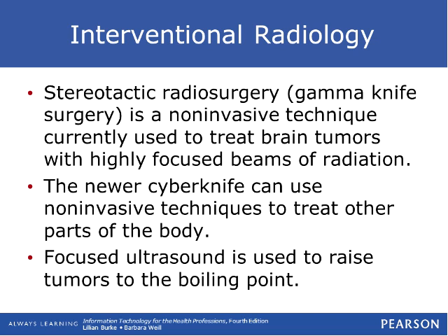Now, interventional radiology is radiology we use, like stereotactic radiosurgery, which is a gamma knife surgery. It's a non-invasive technique used to treat brain tumors, and it focuses different beams of radiation on the tumor. So here's kind of how it works. Think of putting a bowl over the top of their head, and that bowl has multiple radiation guns, if you will, that shoot a very small amount of radiation from different directions. So it's like multiple beams going to one site in the brain.